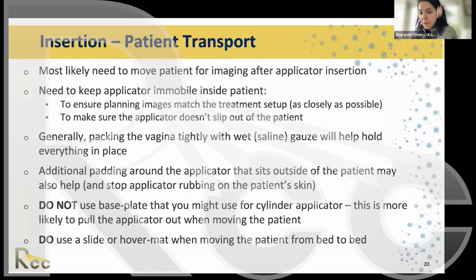Wonderful, thank you. From Ghana, asking if you would advise both insertion and treatment to be in the same session. Yeah, that would be great. It avoids having to move the patient, and that would be an amazing situation. I would love it if in our clinic we could do that, but we can't because our CT scanner is too busy for that. These procedures take us 2 to 3 hours, so the CT people would be really angry at us if we tried. But I would love to be able to do that. If we could buy our own CT scanner and just use it for HDR, that would be amazing.